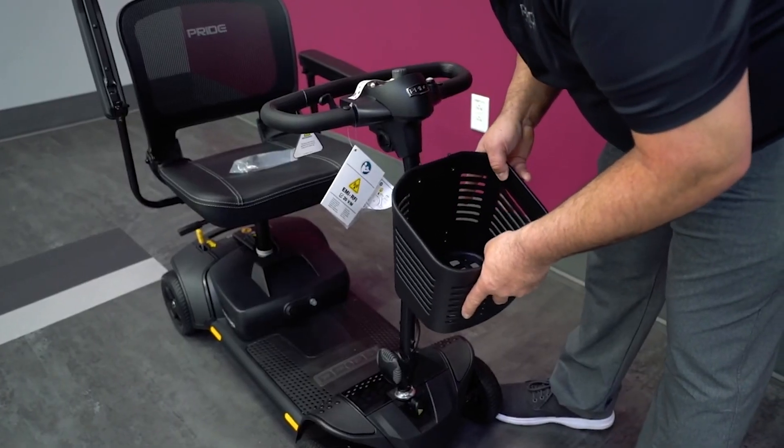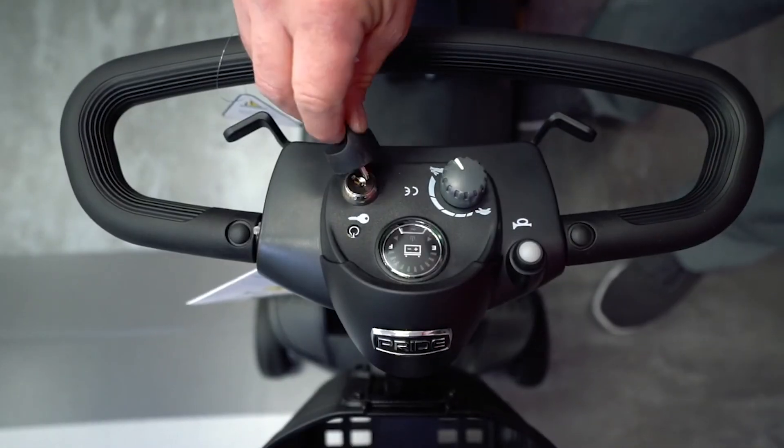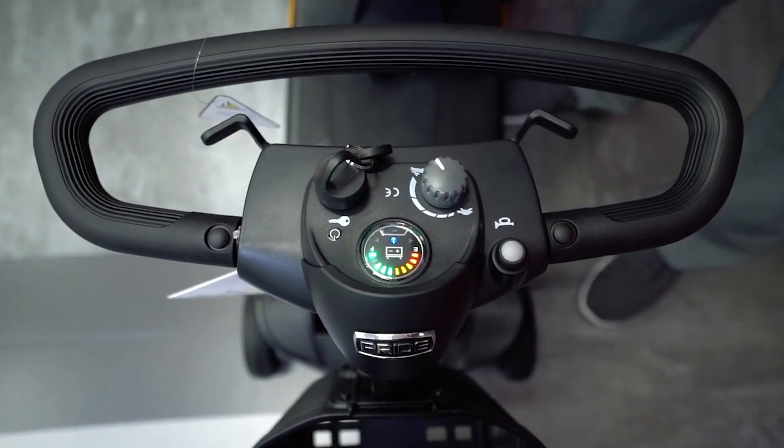Next, secure the front basket over the bracket on the tiller. Remove the sticker on the console and place the key in the ignition to power on the scooter. The battery indicator should illuminate.